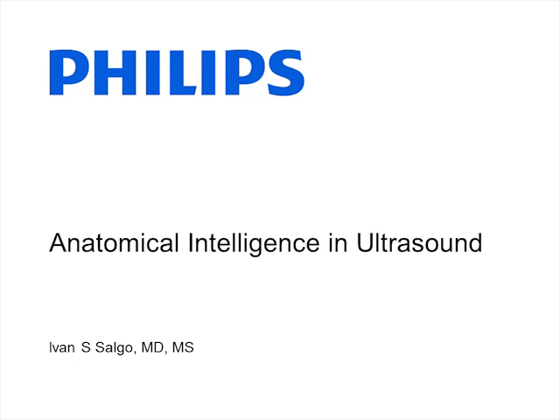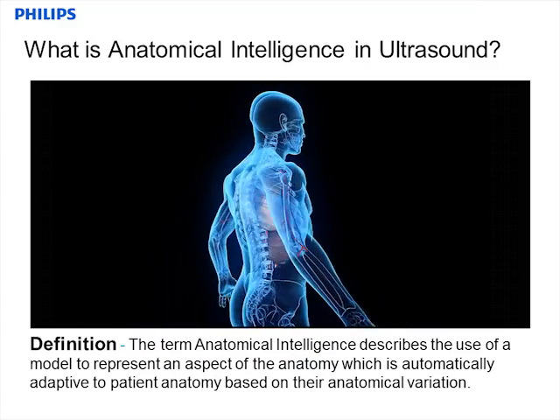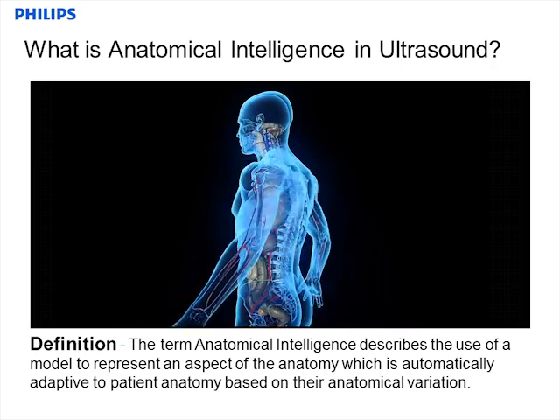Hi, I'm Dr. Ivan Salgo from Philips Healthcare, and I'm going to give an overview today about anatomical intelligence in ultrasound. What is AIUS? AIUS stands for Anatomically Intelligent Ultrasound.